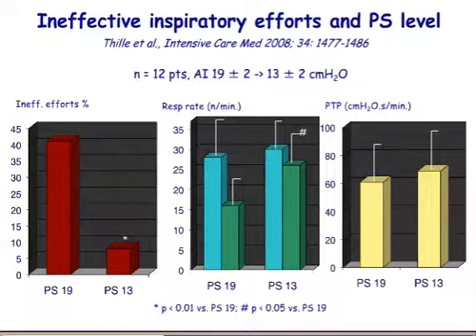And since the ventilator does not see the ineffective efforts, when pressure support was decreased, there was an increase in those breaths that were recorded by the ventilator. The ventilator could see these breaths because now they were all triggering breaths.